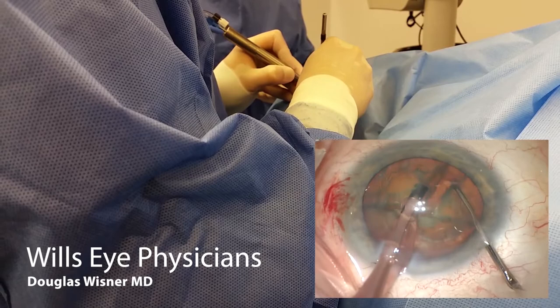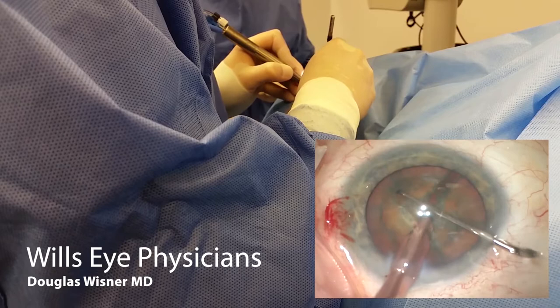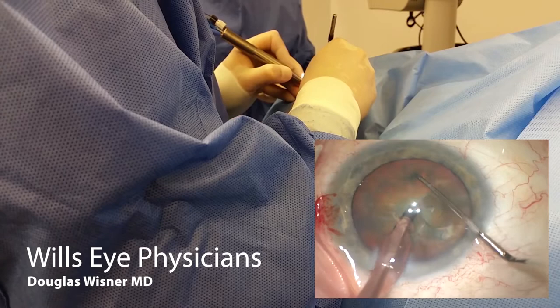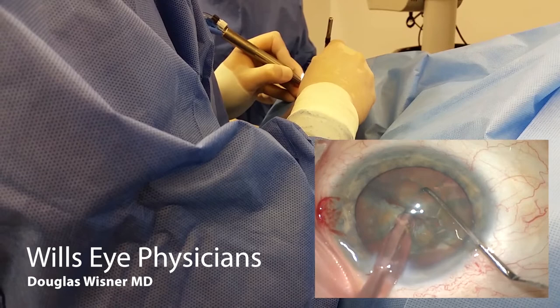Then I'll drop my second instrument in again where I want to make my next crack, go in with the phaco, and spread. There is a little bit of a horizontal motion here; I feel this helps to create a good cleavage plane, especially in dense or soft lenses. Each time you see me dropping my second instrument where I want to make the crack, so I'm having economy of movement — not moving fast in the eye, but all my movements are purposeful.